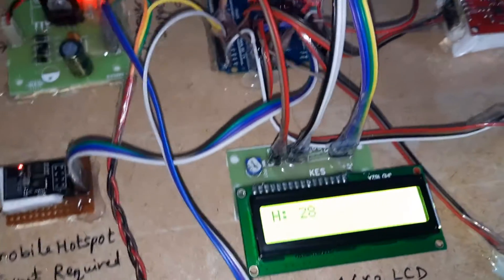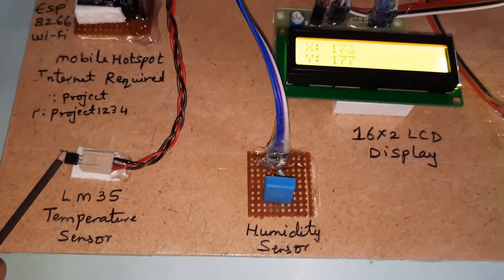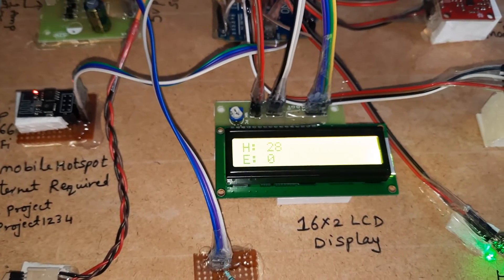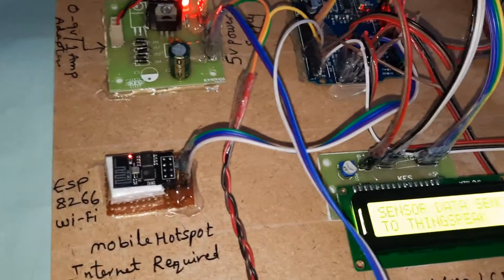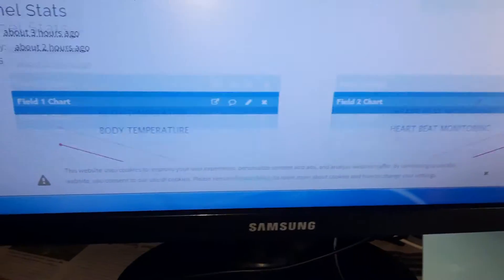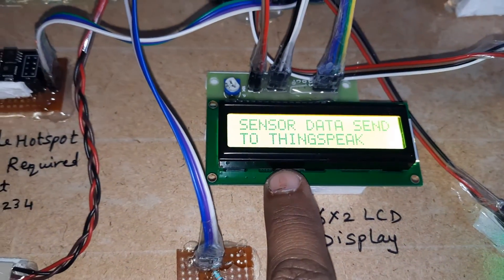T stands for temperature. Now I am increasing the temperature. At 50°C and above, it will send the data to ThingSpeak.